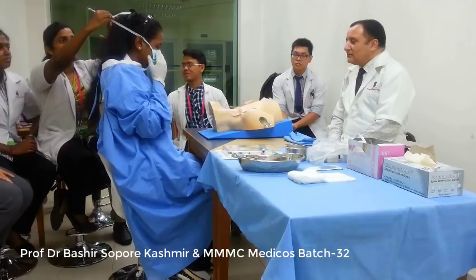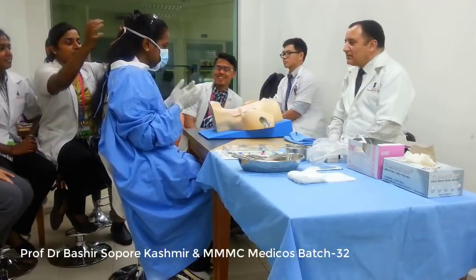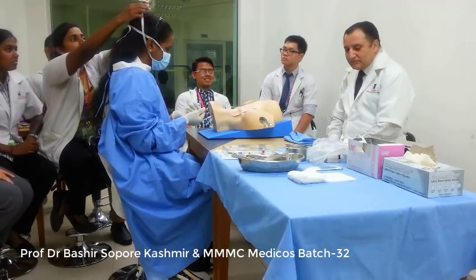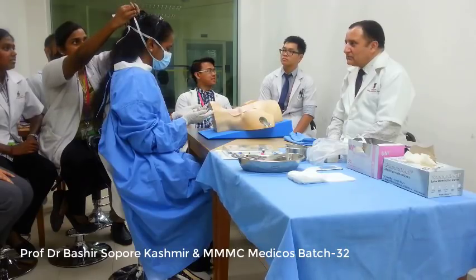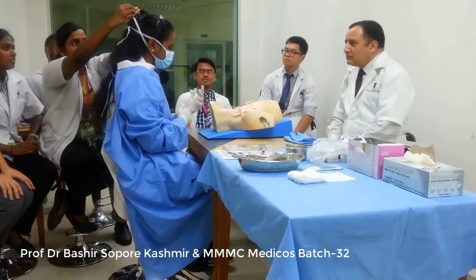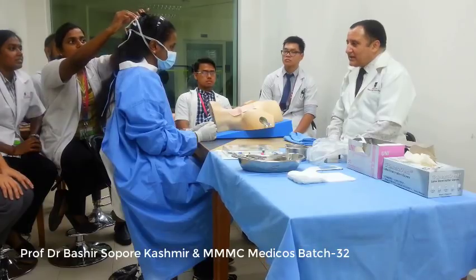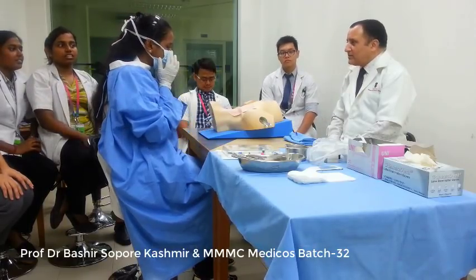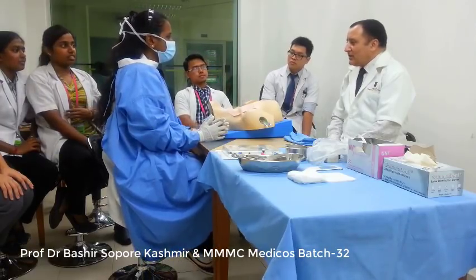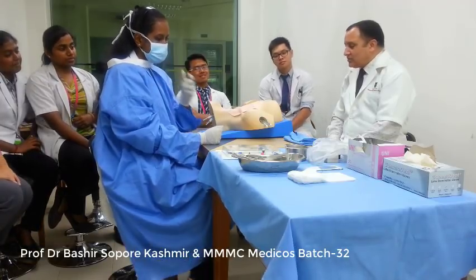And she will try to expose the neck and try to locate the area where she has to insert the needle. But before locating this, she has to see whether all equipment is in order, whether all equipment is functioning properly. She has to check the central venous catheterization kit.